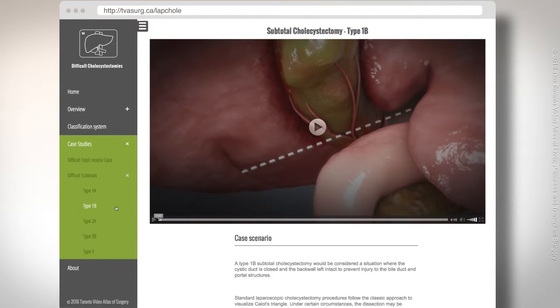One of the anatomic landmarks that we reinforce repeatedly is a line of safety between the sulcus of Ruvier and the Hilar plate. This can be used as a guide to keep a surgeon out of the portohepatus in cases where the cystohepatic triangle may be severely inflamed and inhospitable.